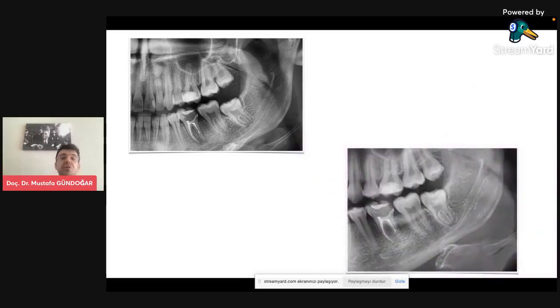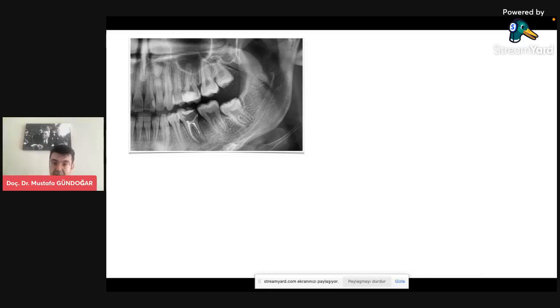And also in this root canal treatment, I couldn't manage to go to the apex. I just cleaned the mesial root canals. In the distal root canal, I couldn't manage to go to the apex. I just retreated. I irrigated it very, very cleanly, and I also used activation systems. And at the end of 1 year, you can see the healing of this tooth, even though I couldn't go beyond towards the apex.